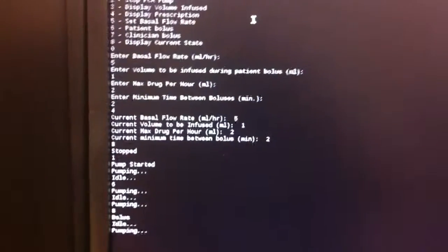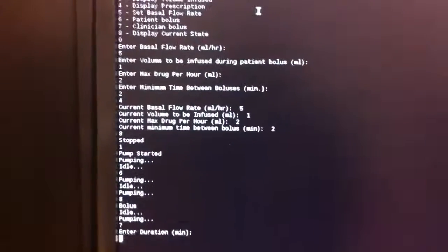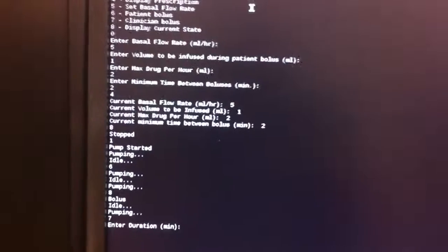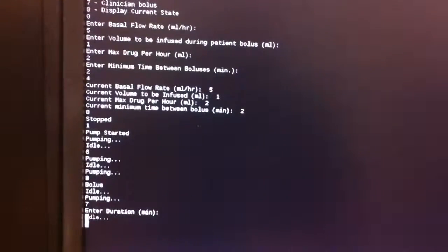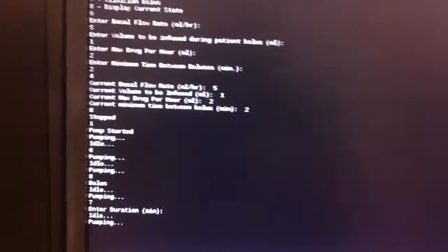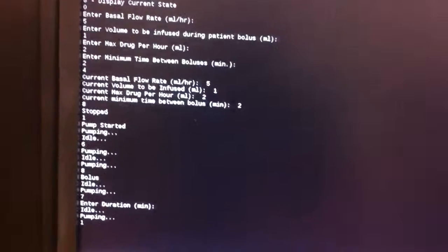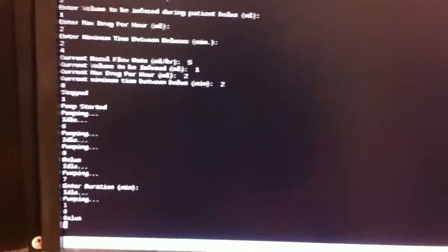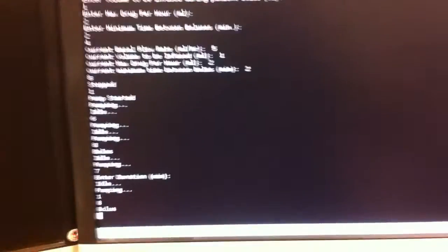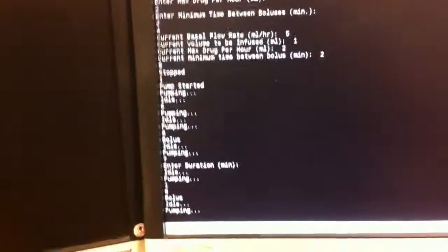the clinician can also issue an additional bolus, and when the clinician requests this, it has a specified duration in which the volume to be infused specified in the prescription will be infused. So let's say I put here 1 minute, and the mode is still bolus, because the clinician bolus waits until the patient bolus finishes, and after that the clinician bolus will start.